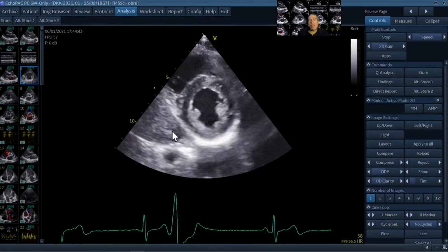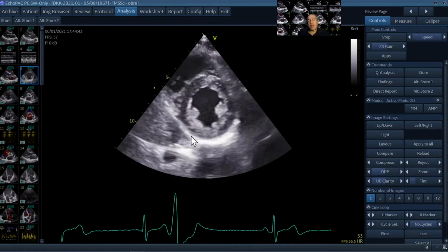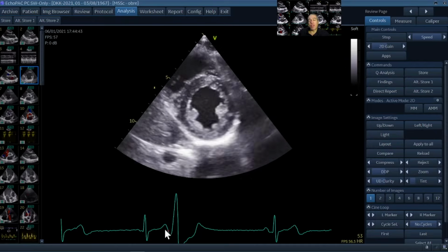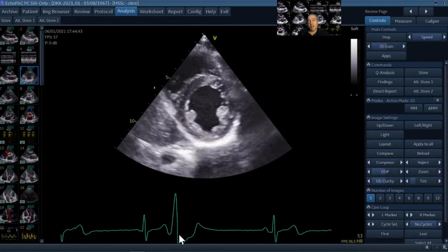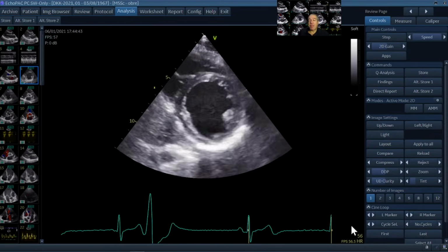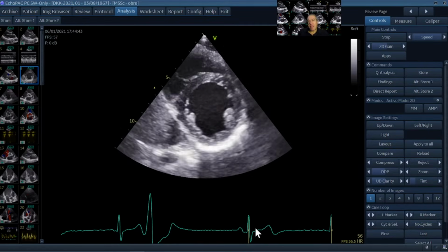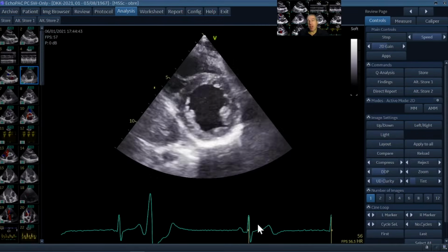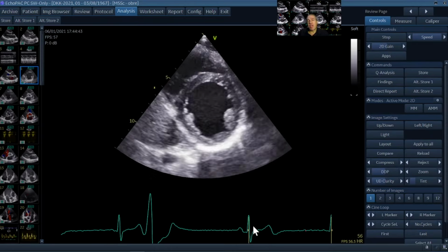When we have done this, we turn the probe about 90 degrees and we take a look at the short axis. Again, here we have a longer sequence, and so you notice a ventricular premature beat. That's the reason for the exam here. But here I focus again on the last cardiac cycle. The last cardiac cycle, always check the ECG, has no premature beats, so that's a normal contraction. That should be the normal situation without any disturbance by arrhythmias.